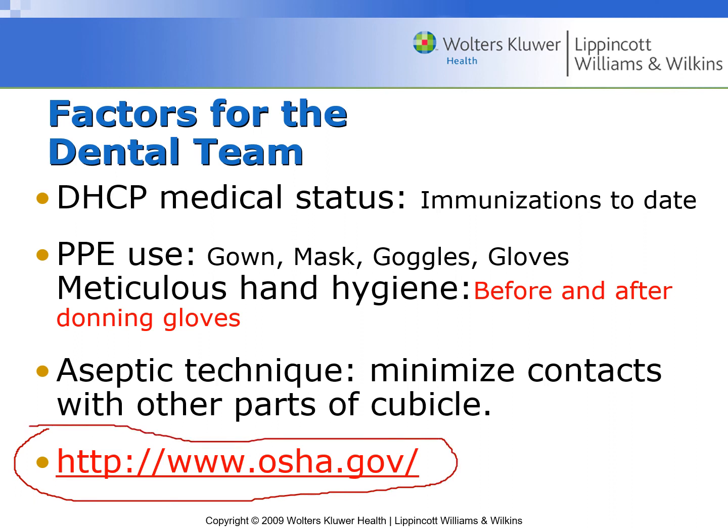So now they are even upgraded to how we sterilize a chair. We need to wash it down with soap and water first, and then leave it wet with disinfectant.